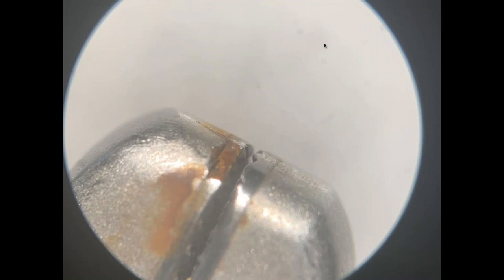I don't see as well, so I need some help to look closer at these instruments to make sure that they are in the shape that they should be in. And like you said, things like this, these tiny chips in the tungsten carbide can be very, very hard to see. Yeah, I think you'd be forgiven for not picking it up with the naked eye, but as you say, it's really important to use visual aids to ensure that they're thoroughly inspected.